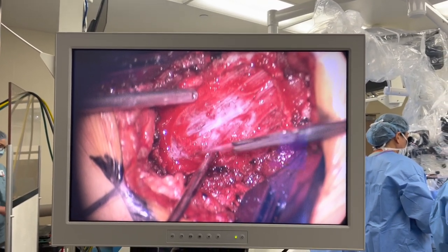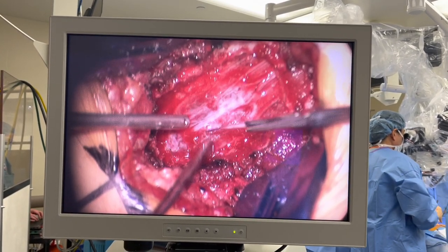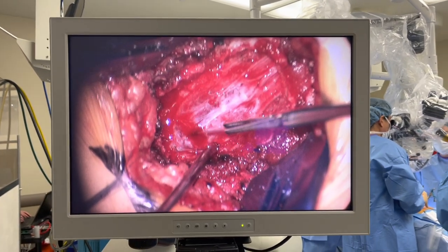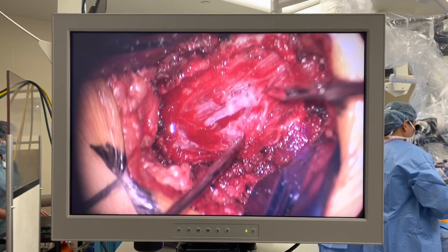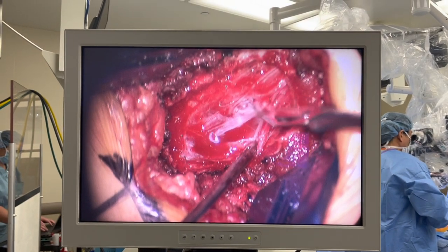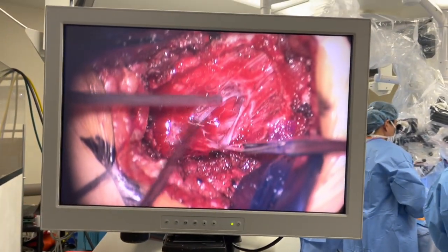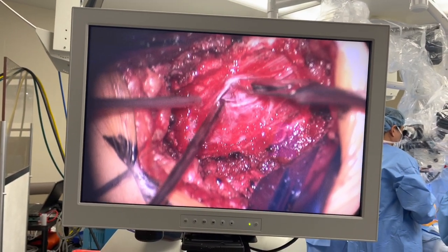So it's not a single cystic cavity like a synovial cyst. It's a honeycomb. Basically, inflammation of all the tiny little reticular membranes that organize the nerve rootlets. Because they don't just sit there and float around willy-nilly. There's an organized pattern. To have an organized pattern, it has to have adhesions. Look at that. I flipped it, so all the nerves are probably plastered to the wall now.